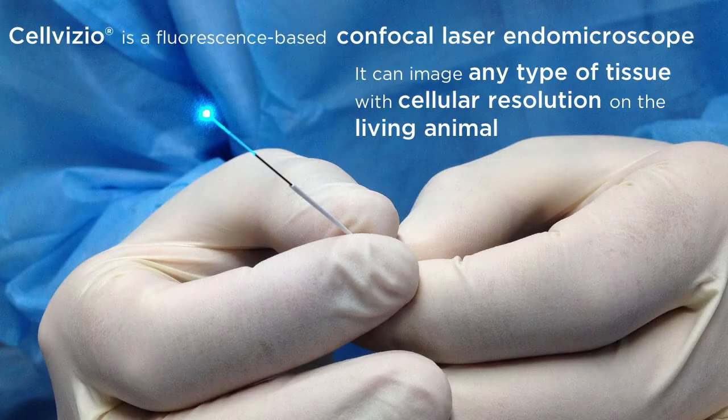So, about the technology, Cellvizio is a fluorescence-based confocal laser endomicroscope. That technology can be used to image any type of tissue with cellular resolution on the living animal. So what you see on the image is a bundle of optical fibers that we use. We put that bundle in contact with the tissue of interest to get that image.